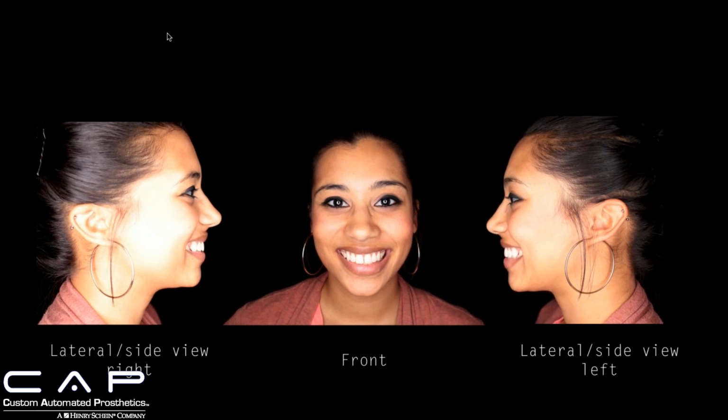So as you can see in this next picture here, I've got a picture of her straight on, and then a lateral side view of the right and the left. And this is actually more helpful than you might think, especially if you're doing multiple restorations. It's good to see her natural smile line, to see where the lips fall on the tooth, how much she exposes of her dentition, and the side view helps to see the angulation of anterior teeth.